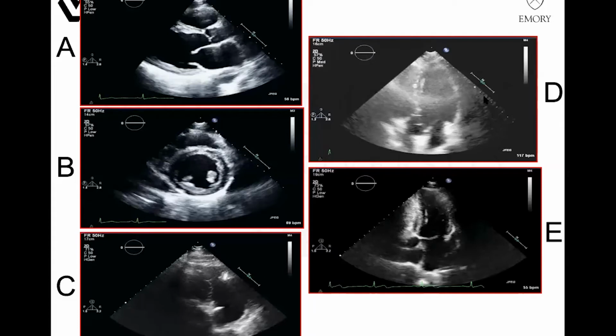D is actually, oh, you're correct. Yeah. Thank you. Sorry. D is actually tilted up from the, well, it can be an apical 3-chamber view or a 5-chamber, but it's not a 4-chamber view. E is definitely a 2-chamber view. All right, so the answer is D.